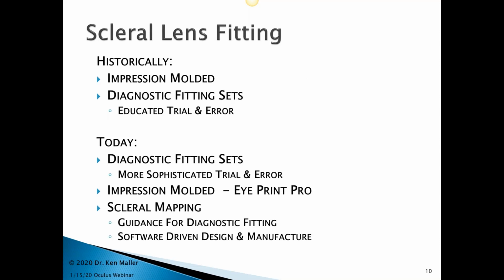Now, historically, these started out as impression molded, as well as we had diagnostic fitting sets.